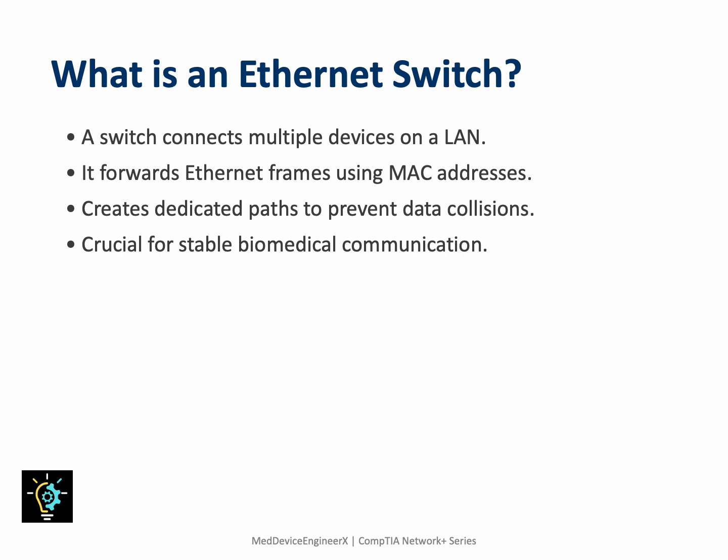An Ethernet switch learns where devices are by reading their MAC address and builds a forwarding table. Unlike hubs, which broadcast data everywhere, switches send data only where it's needed. In hospital networks, this precision ensures clean, isolated communication between devices such as ventilators, computers, and patient monitors.